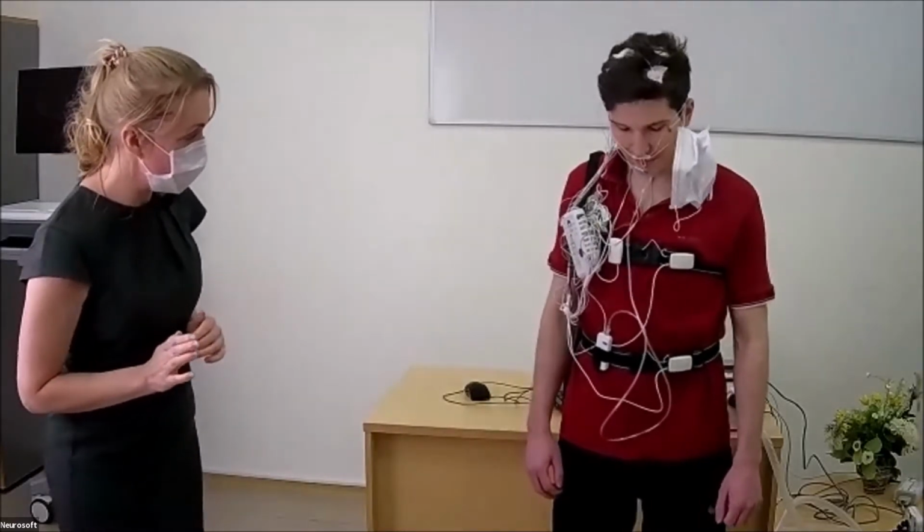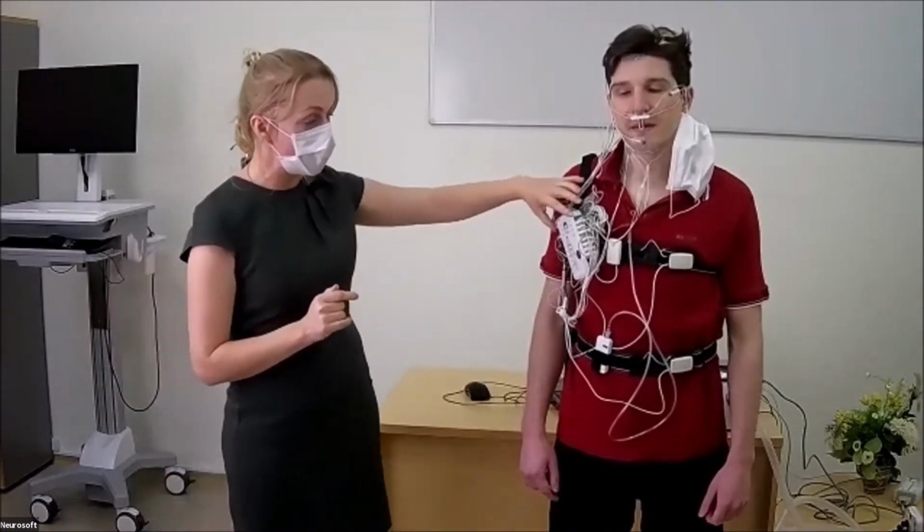The last sensor, which we don't put on our patient yet, is a pulse oximeter sensor, and we put this sensor when we start our test. So we will use the Neuron-Spectrum-65 system during our test, and this system is connected to the computer with a cable, and we need to use a patient unit when we use the Neuron-Spectrum-65 system.